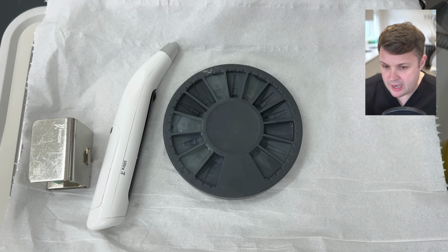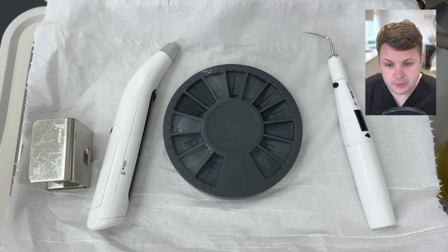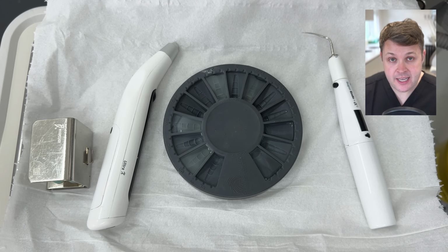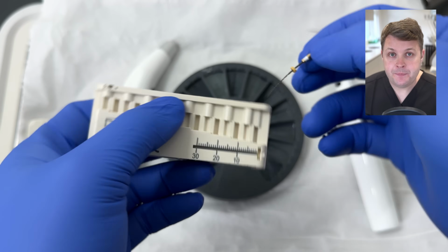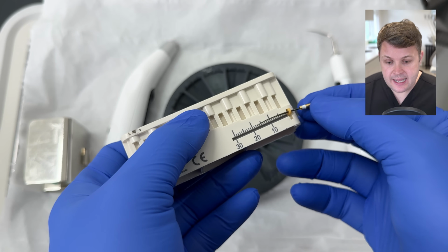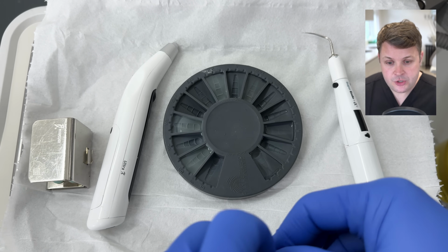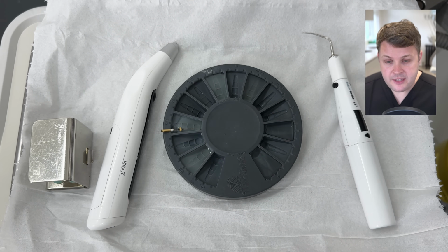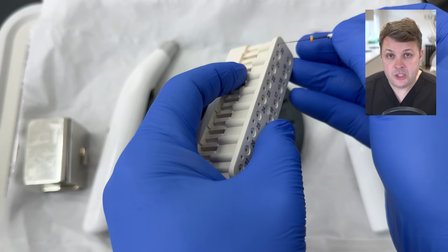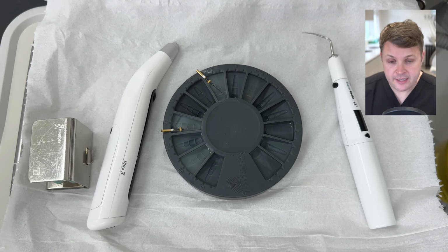We're going to use our ultrasonic activator, and then we're going to use our heated plugger. Because we're using a bioceramic in this case, I'm not going to use my backfill unit. And then finally, I'm going to measure 2 of the glide path files to about maybe 1 or 2 millimeters away from the working length. These are going to be placed into my disinfectant ring, and eventually used to introduce the bioceramic into the full length of the canal.